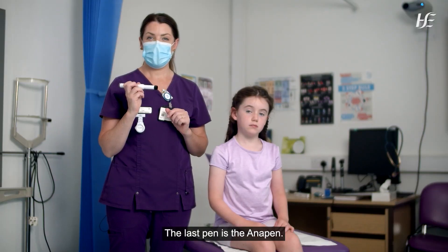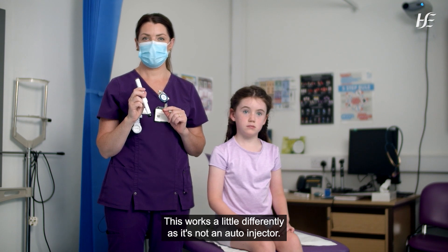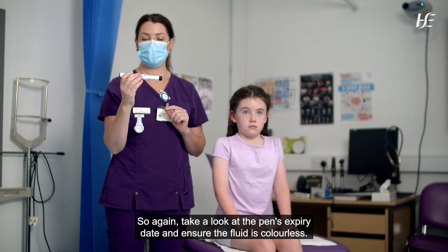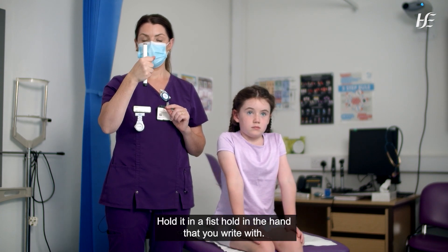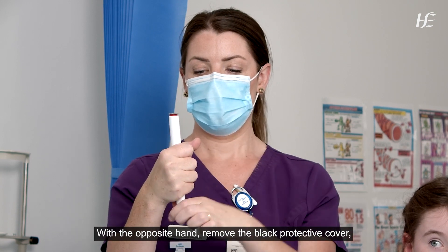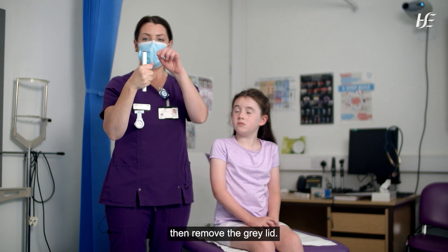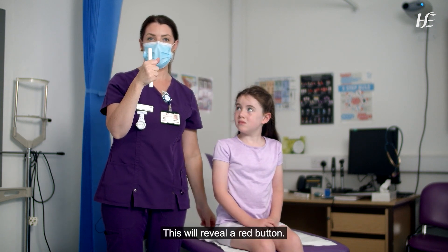The last pen is the Emerade Pen. This works a little differently as it's not an auto-injector. Take a look at the pen's expiry date and ensure the fluid is colourless. Hold it in a fist hold in the hand that you write with. Think: grey to the sky, black to the thigh. With the opposite hand, remove the black protective cover, then remove the grey lid.